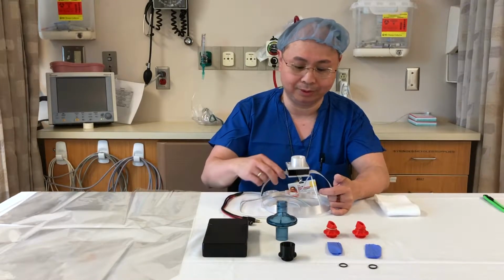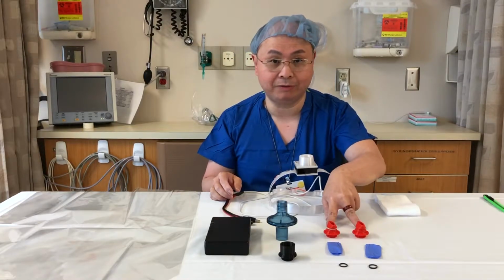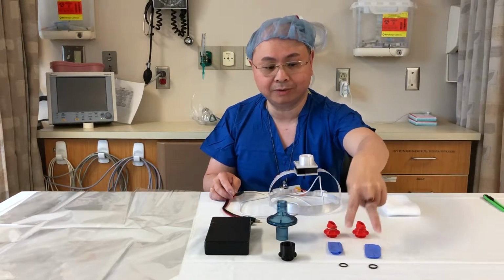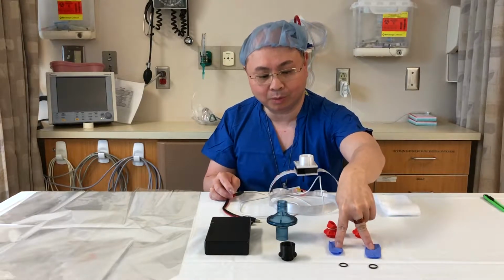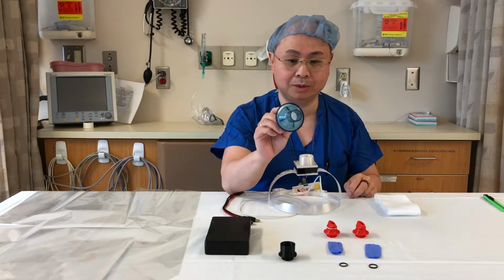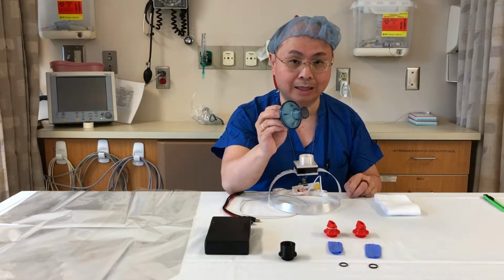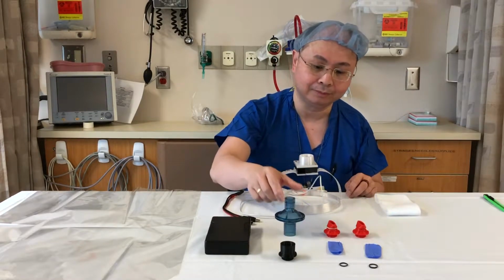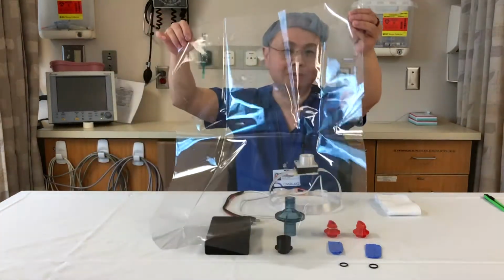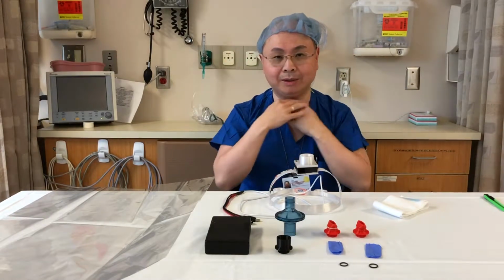First, look at the parts that you have. The Bunny PAPR itself, your power supply, flutter valve fittings, fingertips that have been cut off from a glove to create your flutter valves, small rubber bands to secure the rubber fingers onto the flutter valve fittings, an anesthesia viral filter. This is what's used to protect patients during anesthetic cases, and this has a greater than 99.99% viral removal efficiency. Viral filter adapter, a plastic bag to serve as your hood, and finally, a strap to secure the hood around your neck.